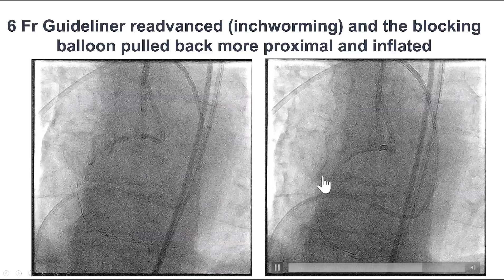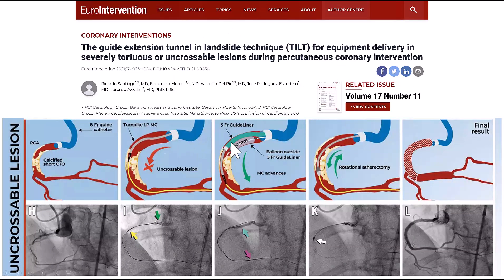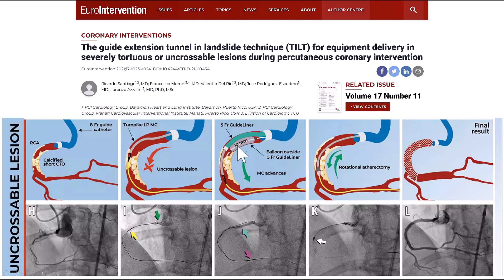Over the original guidewire, we were able to pull the balloon back and inflate it. This is what we call the TILT technique — Tunnel In LandSlide — which essentially means we have a guide extension going down the vessel, and next to it a separate guidewire and balloon that pushes the guide extension against the vessel wall. This does two things: first, it provides extra support for delivering a covered stent at the site of perforation; and second, the inflated balloon prevents blood flow from going downstream and exiting through the perforation. This is the block and deliver technique — blocking antegrade flow with the balloon while the guide extension, supported by the balloon, acts as a powered guide extension for delivering the covered stent.